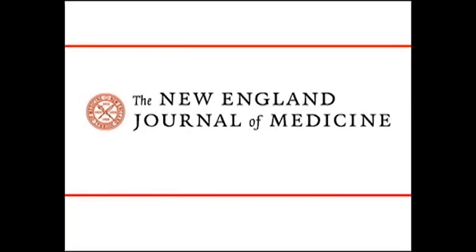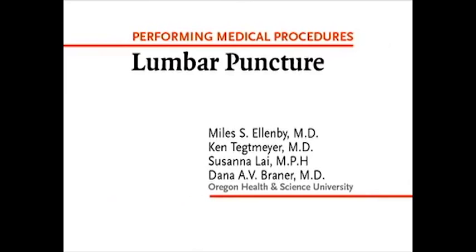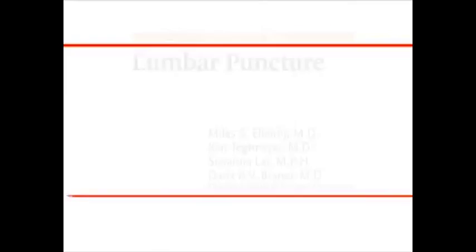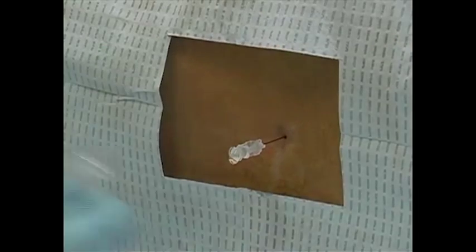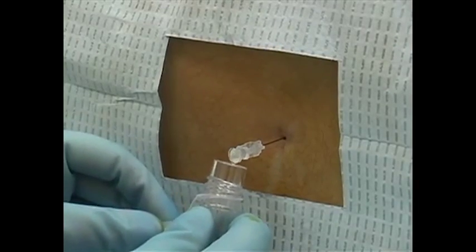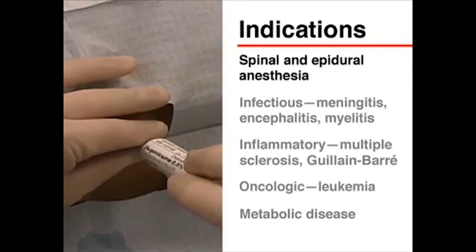This is a video in clinical medicine from the New England Journal of Medicine. This video will demonstrate safe and successful methods of performing lumbar puncture. Lumbar puncture is indicated for both diagnostic and therapeutic purposes. Also, the administration of spinal and epidural anesthesia involves, essentially, the use of this same technique.